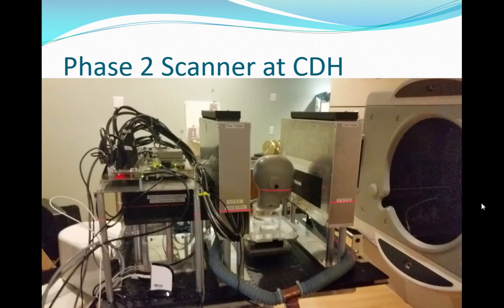Okay, so this is the actual device. You can see here are our two detectors. This big box down here, encased in solid material all around, is where our scintillators are, to prevent light from getting into it and polluting it. This is where the scanning beam comes through.